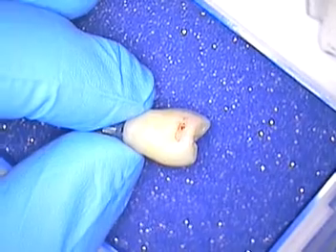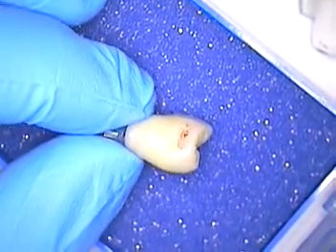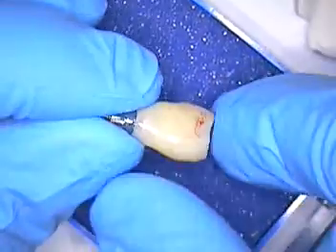Hello, good morning, and welcome back. This is Dr. Jerry Cuomo. I'm here in my Boca Raton office to finish up Mark's case, which is a screw-retained single-tooth crown.